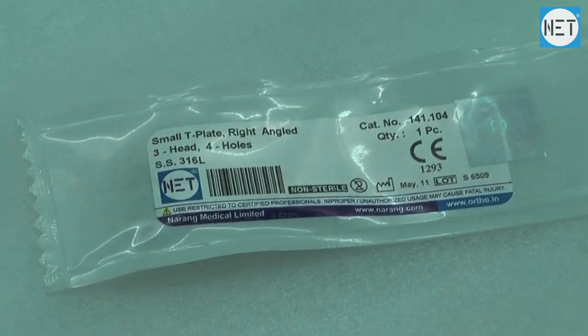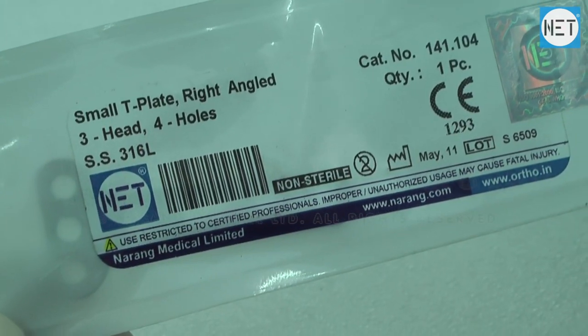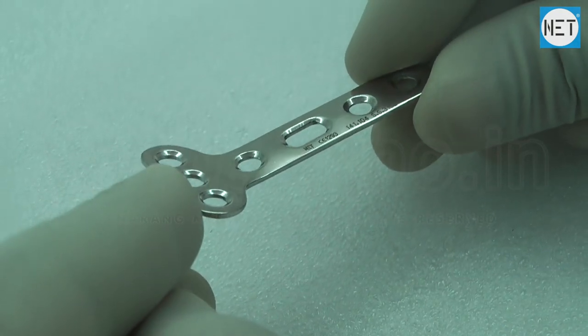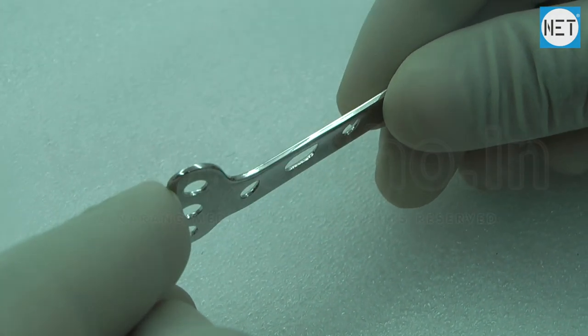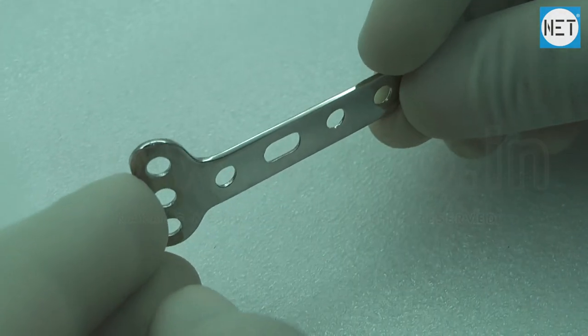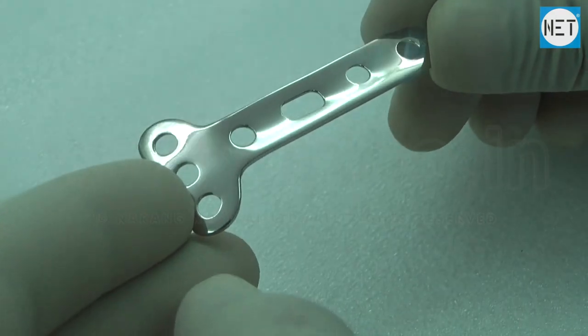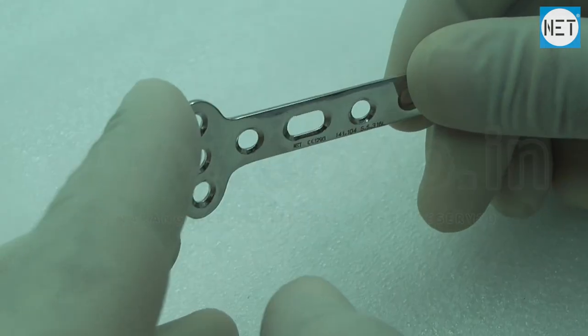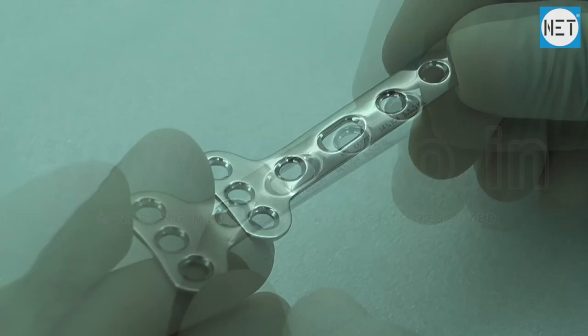Net Brand Small T-Plate 3.5 mm. These plates are used for fixation of partial articular or split metaphyseal fractures of long bones, proximal and distal part of humerus, radius, ulna, tibia and fibula.